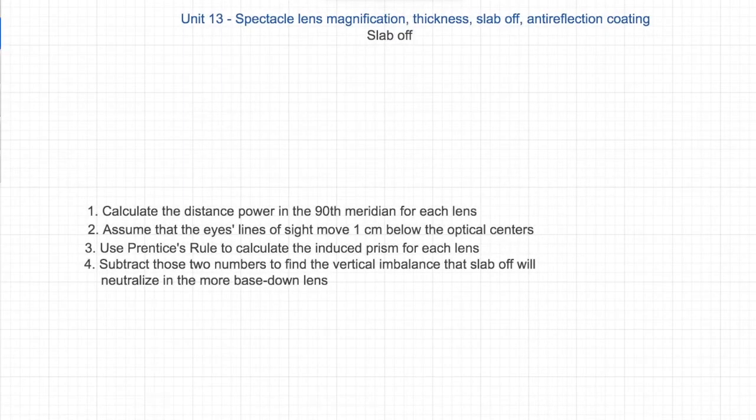So we all heard about Slab Off in the Karate Kid movie, where Mr. Miyagi tells Daniel-san, "Slab on, slab off." Of course, the relationship between self-defense and optics is that you're not supposed to hit anyone who wears glasses. So just wear your glasses and you are safe.